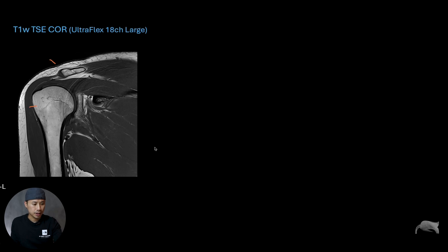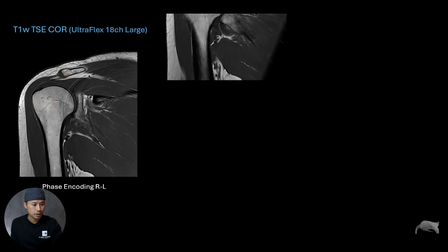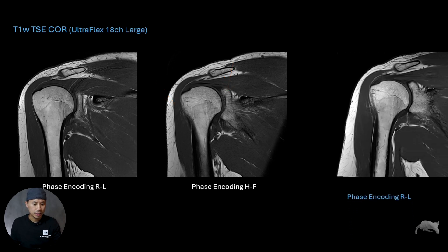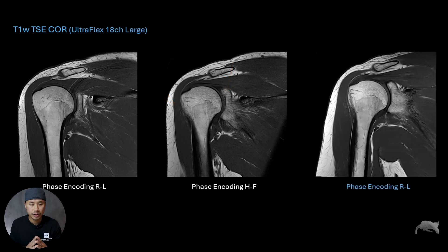This artifact is in the physical right-left direction. What you can do is shift the phase encoding direction; however, if you do that, you only shift the problem to the other direction — in this case, head-to-feet. So what we did here is keep the phase encoding direction right-left, and as you can see on this image there is minimal motion artifact. It's the same test patient with this theory put into practice — you either eliminate it or minimize it significantly.